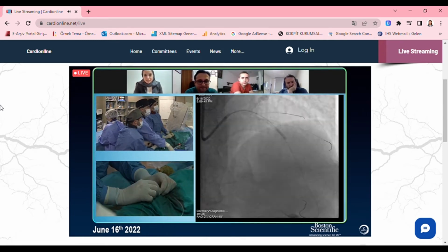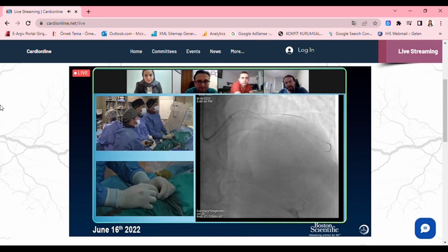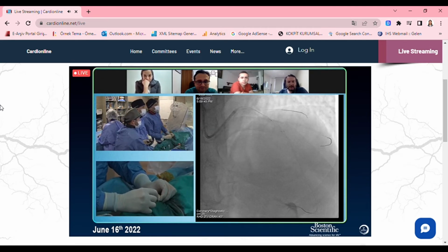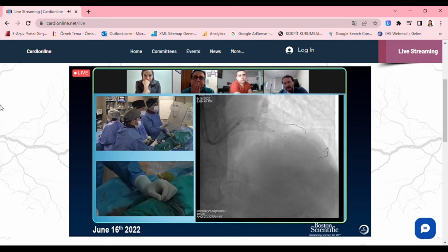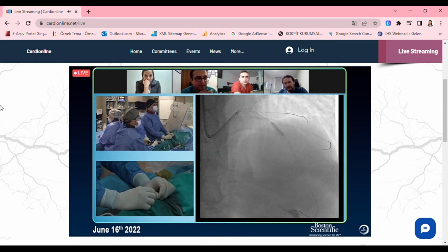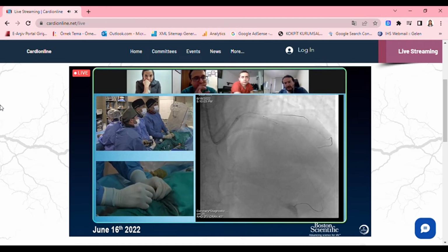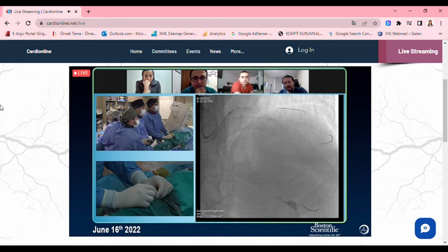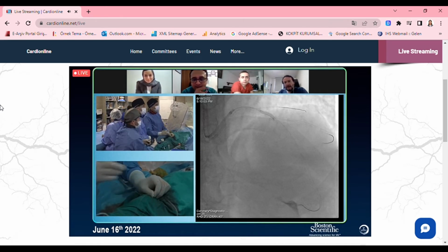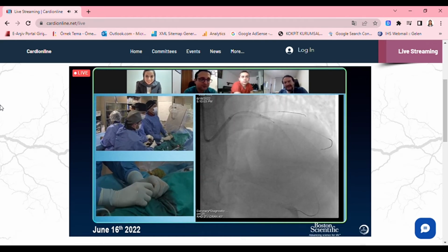So it's open nicely. This is one of the lesions. It's open nicely, but before inserting the stent, I like to go at the proximal part with the 3.5, up and down. If you look at the proximal part of the LAD, where most of the calcium is, it actually has 3 wires. So even an NC will work like a scoring balloon here. 3.5 by 15, with 2 other wires around it. Yeah, poor man's scoring balloon.